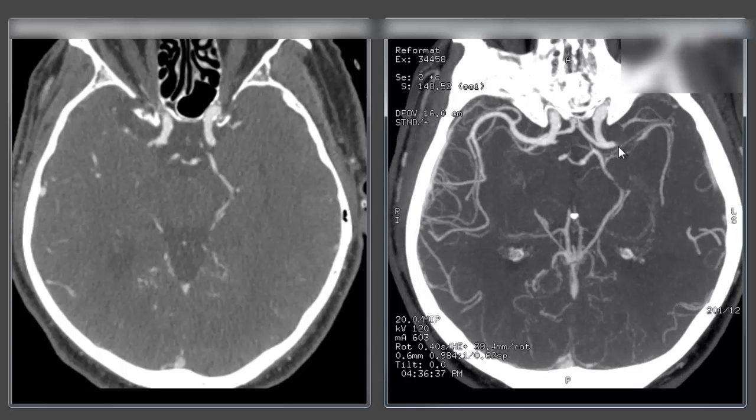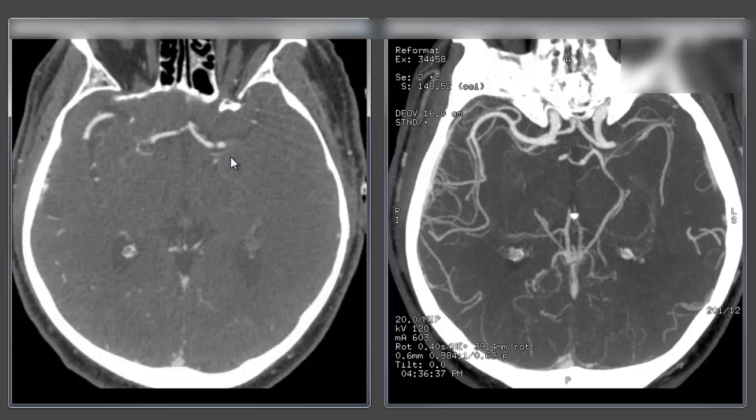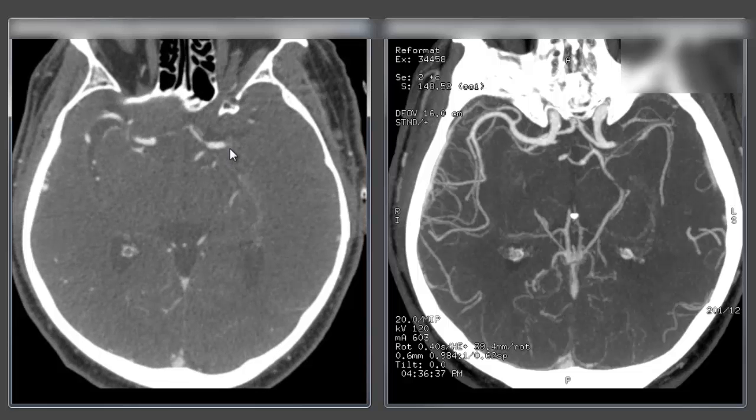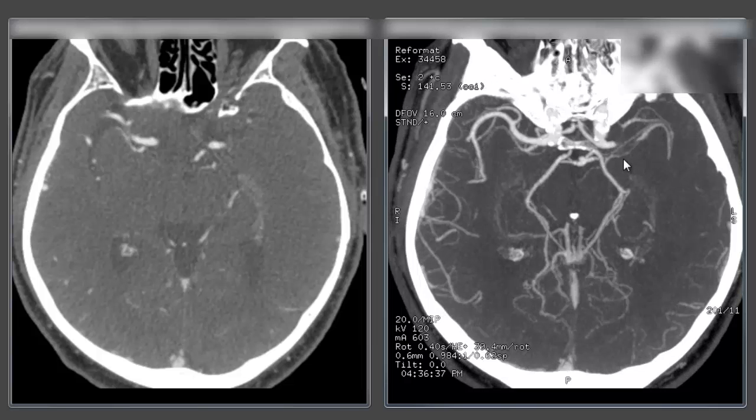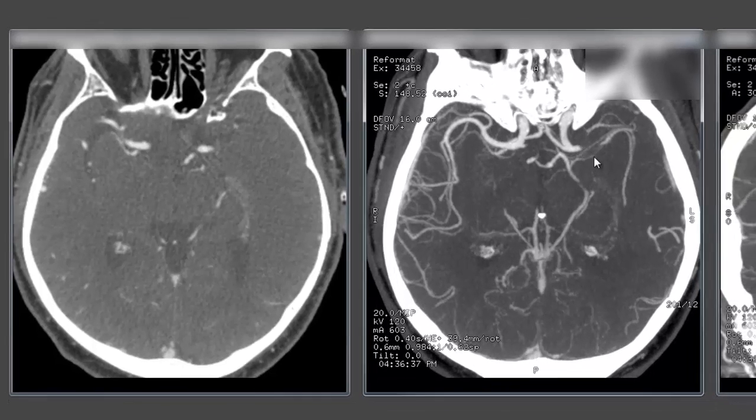It's very easy to see this large artery occlusion on the left side which of course you can see on the source images and you need to confirm it on the source images. But using the thick MIPS reconstructions makes it that much easier to see on a first pass evaluation. So that's one of the major uses in the acute stroke setting, to very quickly ascertain yes, here indeed is a large artery occlusion.